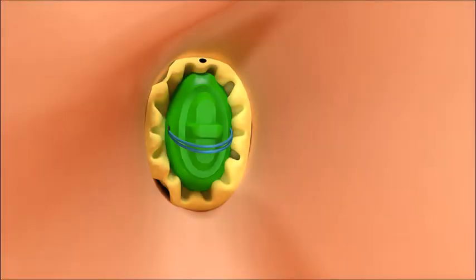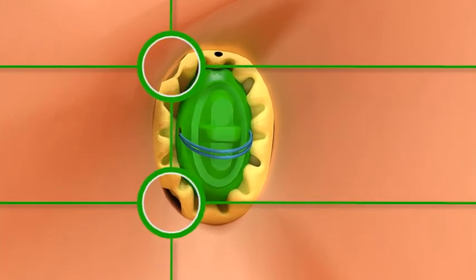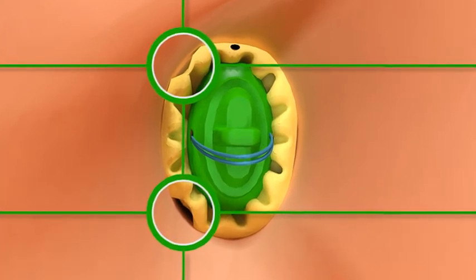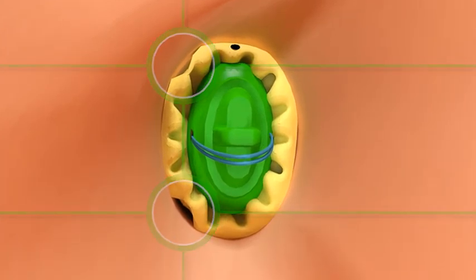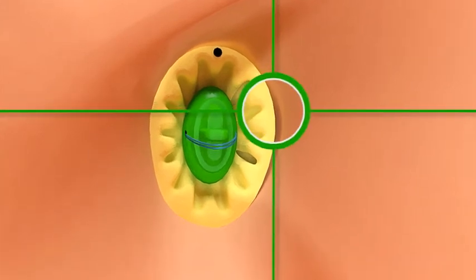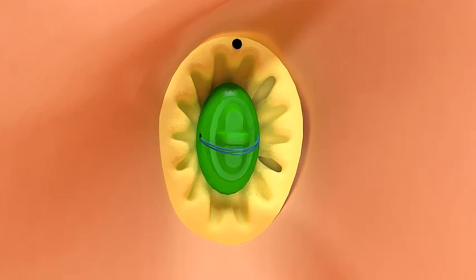If the ear canal is too narrow for the small sizer, you will see folds between the seal and the canal wall. In that case, the sizer is too big, and you should try the extra small sizer. If the extra small sizer is still too big, the ear is contraindicated for Lyric use. If the ear canal is too large, you will see gaps between the canal wall and sizer, indicating that you should try a larger size.